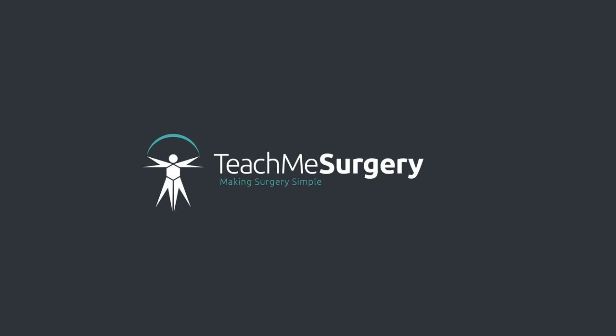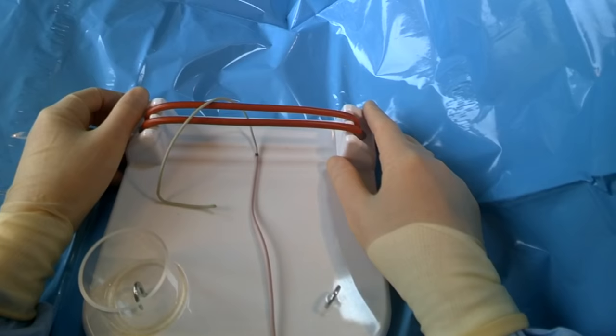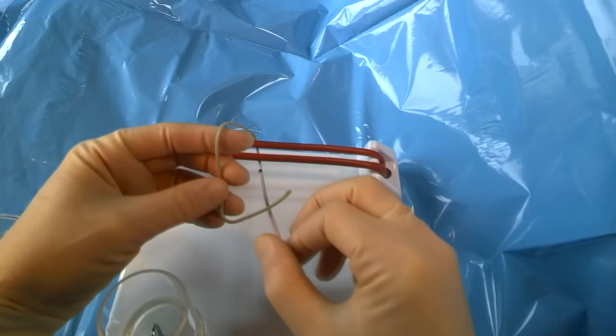In this video we're going to demonstrate how to do a one-handed knot tie. What we have here is our knot tying jig, our thread, and what you can see here is we've got a short thread and a long thread.